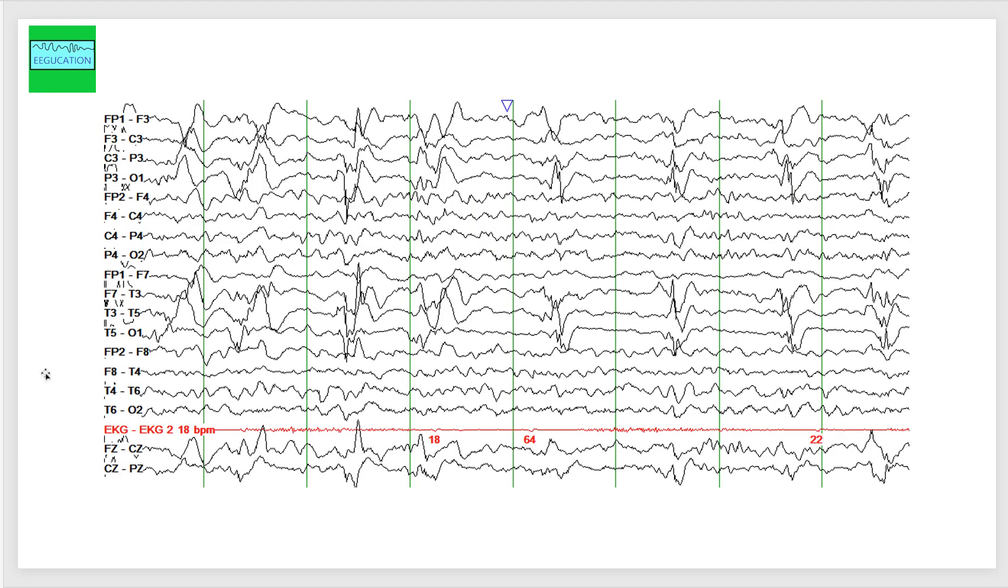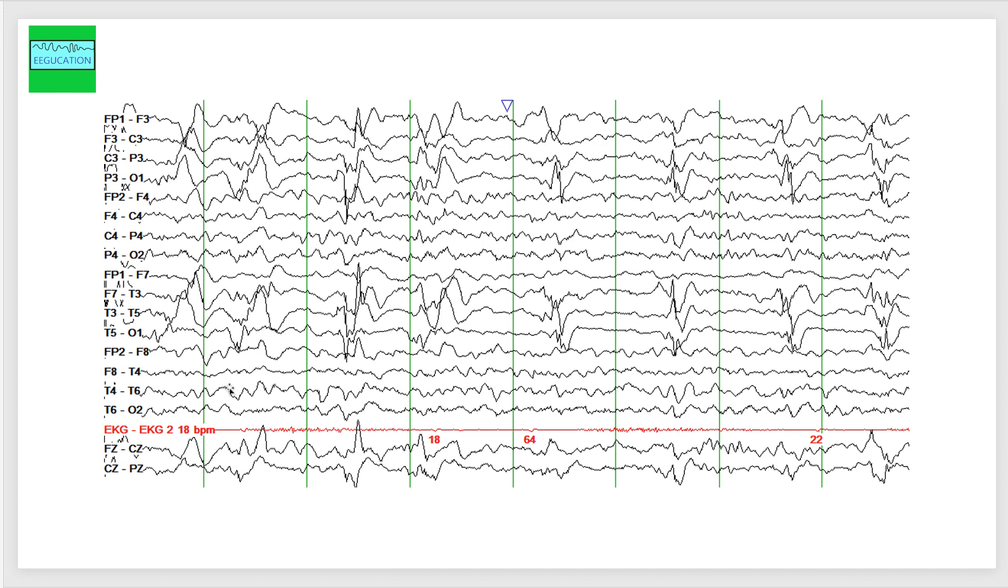As we see on the EEG, this patient had periodic lateralized discharges, which are unilateral affecting the left hemisphere. These were previously called PLEDs, which stands for Periodic Lateralized Epileptiform Discharges. American Clinical Neurophysiology has revised their terminology, so you can go to their website to look at the current terms that are being used.